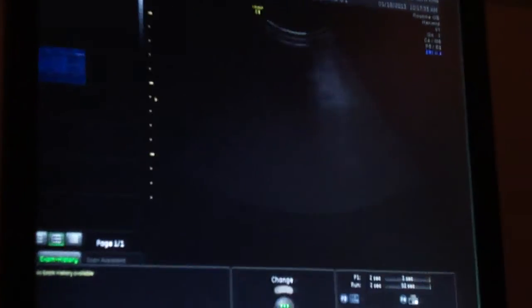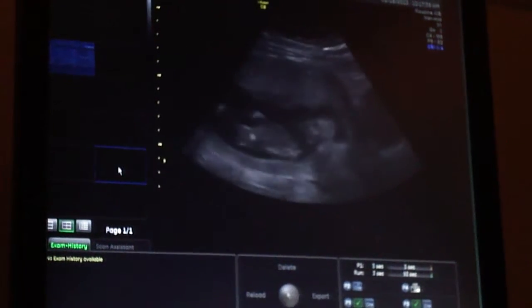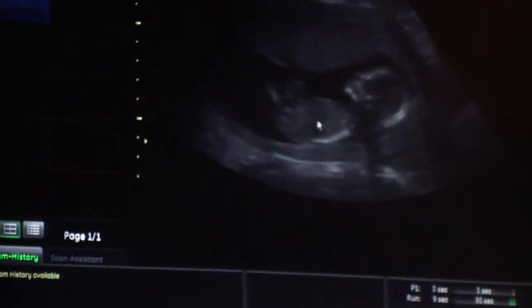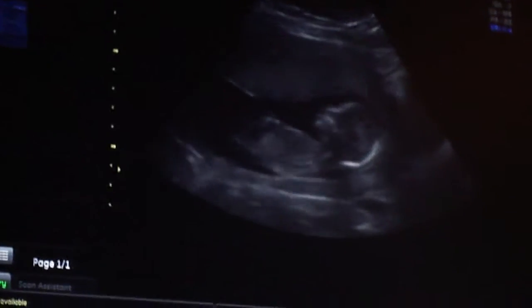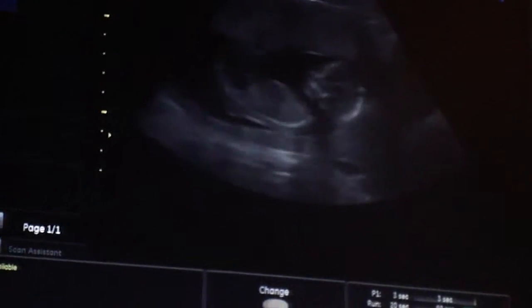Let me get you familiar with things and then I'll point out to you what I'm looking at here. There's a baby here — this is the baby's head. There's a little heart moving and then the baby's bottom. It's kind of stretching those little legs right out there.